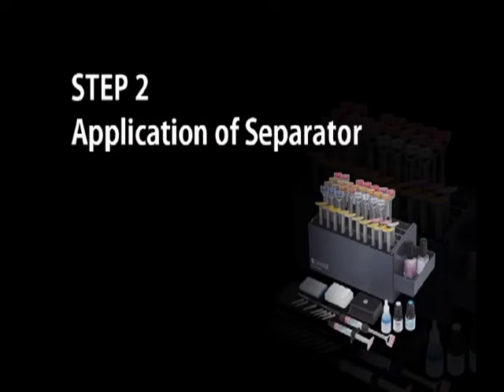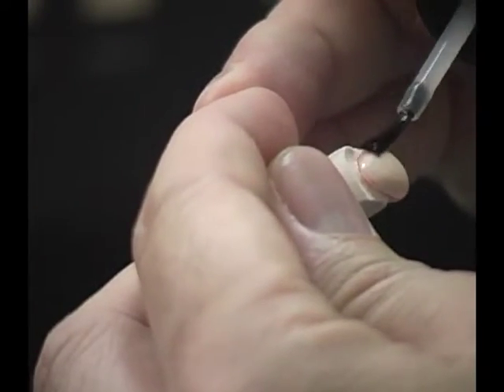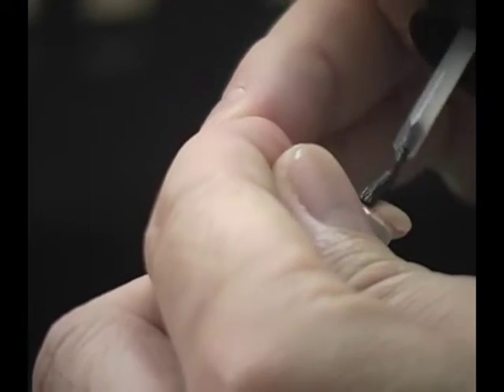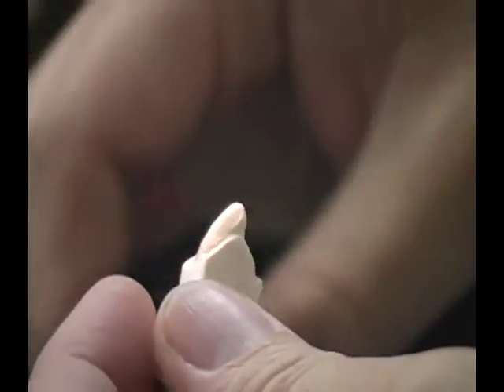Application of separator. Apply the Ceramatch separator in a thin, even layer on the entire build-up surface. This step is very important for easy separation after veneer fabrication.